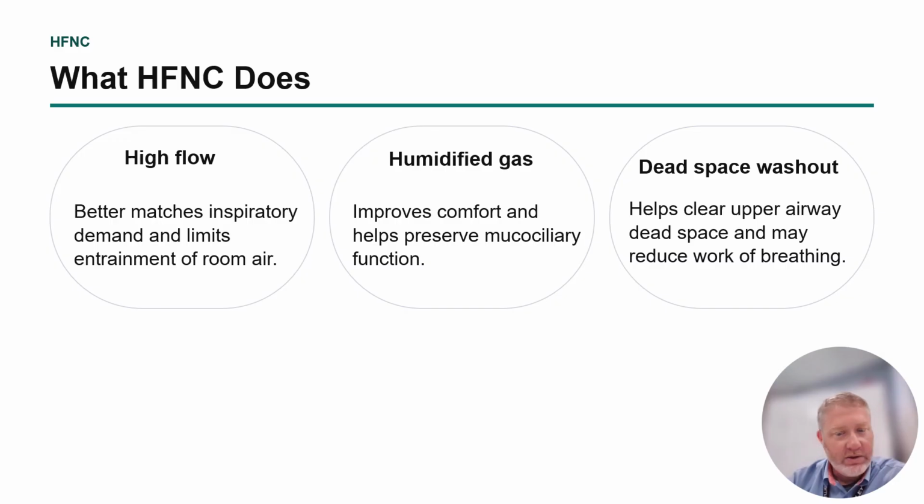Second, typically they deliver warm and humidified gas, which improves comfort and helps to maintain mucociliary function, like we talked about in one of the previous lectures. Not all high flow systems have a heated humidification with it, especially in the field on transports.